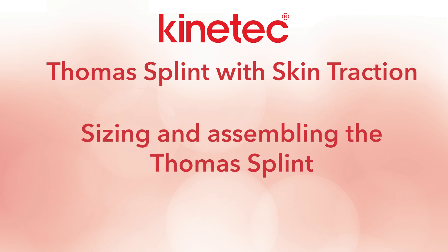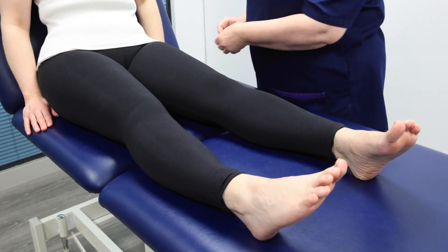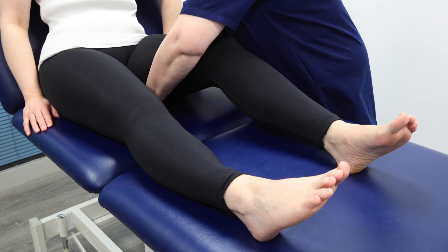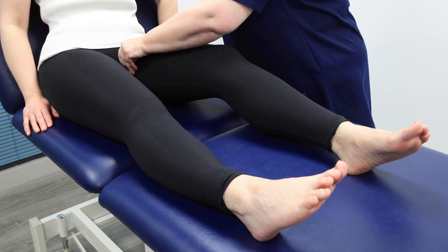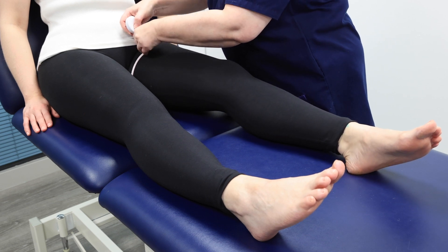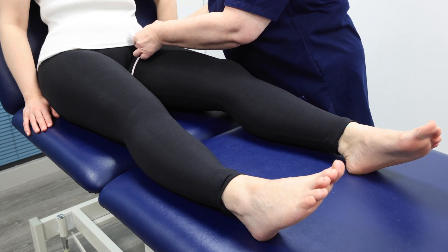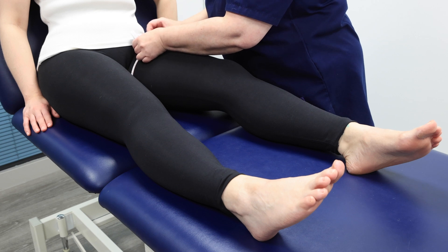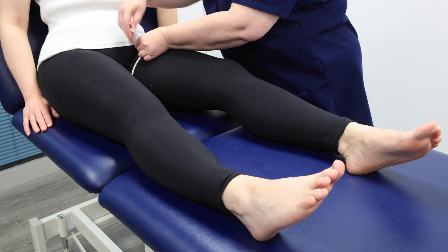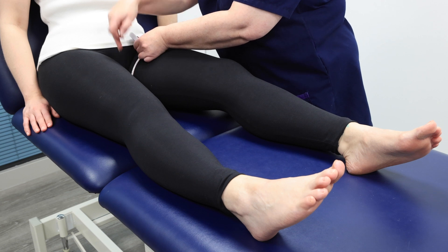Sizing and assembling the Thomas splint. Start by measuring the patient's uninjured leg — measuring the uninjured side avoids unnecessary pain and discomfort. Measure the ring size using a tape measure from the groin, slightly oblique. In this case the measurement is 62 centimetres.